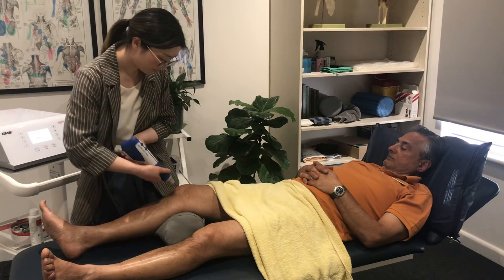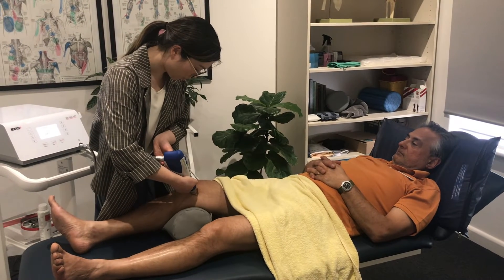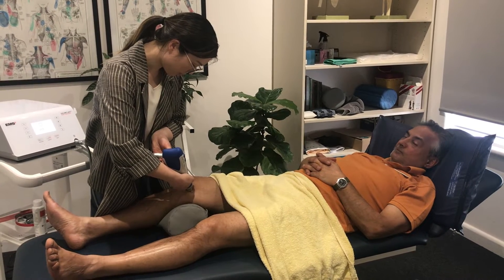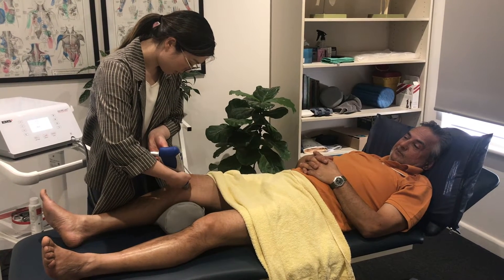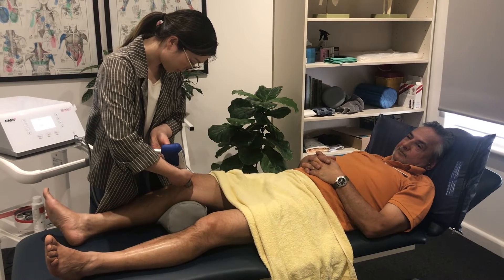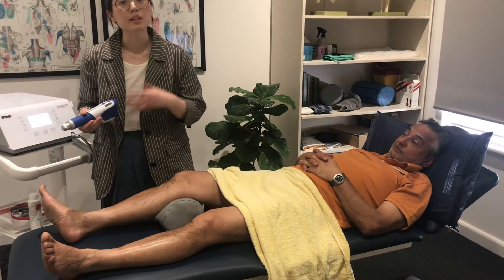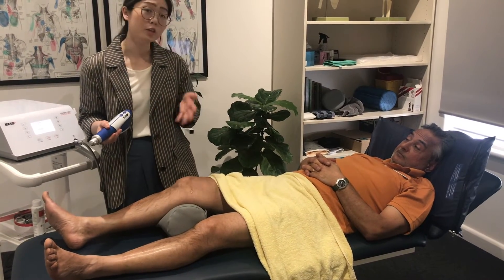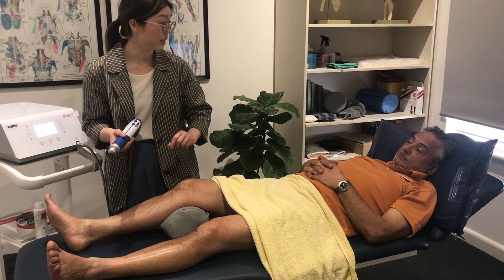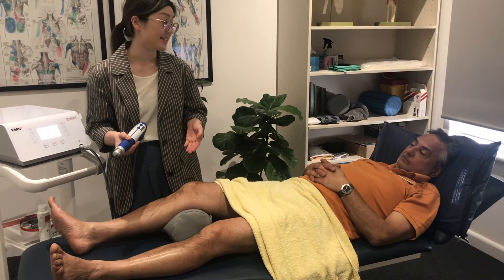Once we've found the area, we apply the shockwave — three, two, one. We would keep that treatment on for four to five minutes, and following that, reassess by palpating along where the joint line is for how sensitive it is, but also retest afterwards.